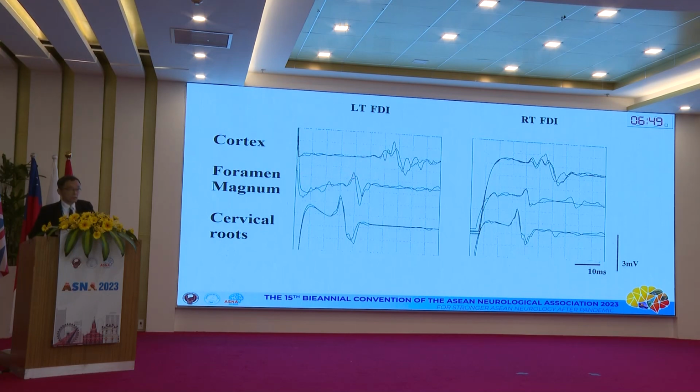So an intracranial lesion causes something like hemiparalysis. However, this time the amplitude is not so different. So even at 5 millisecond, 10 millisecond, the muscle power is as usual. MMT shows no weakness in this case. So a subclinical lesion could be detected with these methods.